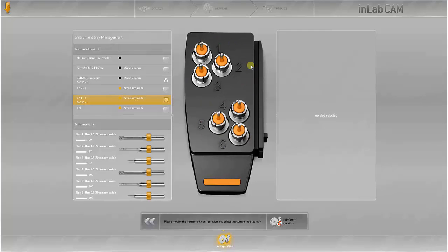To change a tray, select the desired tray in the software and then exchange it manually in the machine.